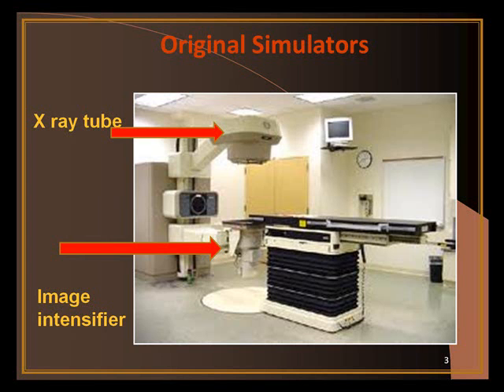Okay, and then you could turn on the X-rays, and then this monitor will show you. It's basically a fluoroscopy unit, so this monitor will show you what's going on in the patient's anatomy. These have pretty much been replaced. This is called an image intensifier.